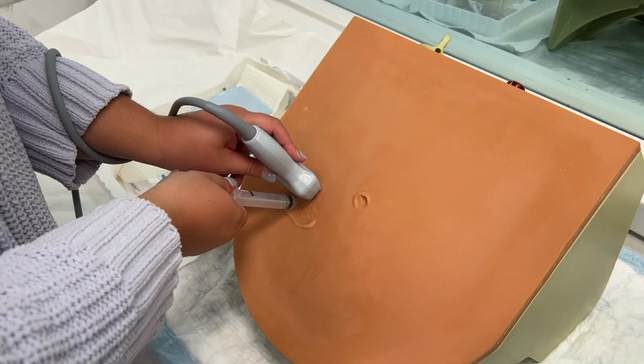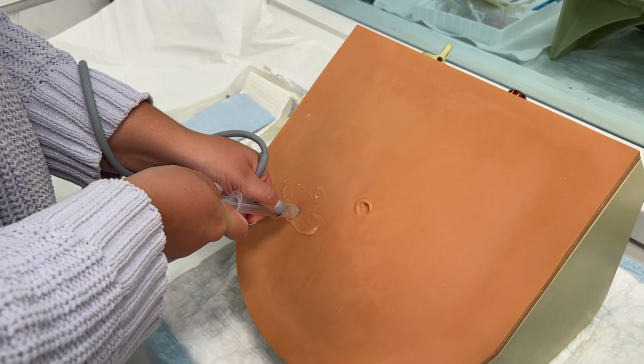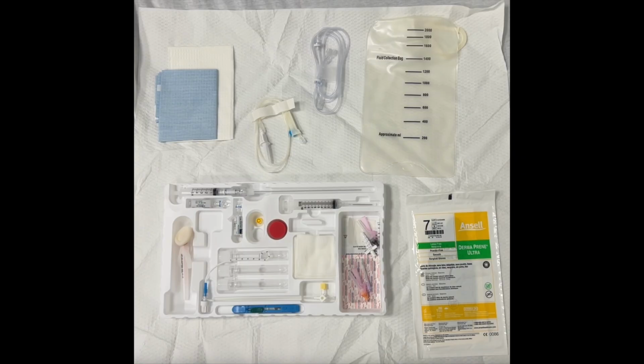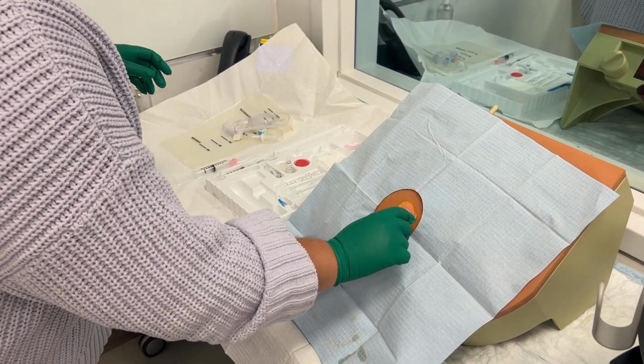Once you identify a pocket of fluid, you can mark the overlying skin by using a syringe and pulling back. Most emergency departments will have a kit similar to this one. The kit includes the sterile draping, the tubing, fluid collection bag, as well as materials for cleaning, the needle with the overlying catheter, as well as the scalpel, and anesthetic materials. For time's sake, we will not review how to form the sterile field.